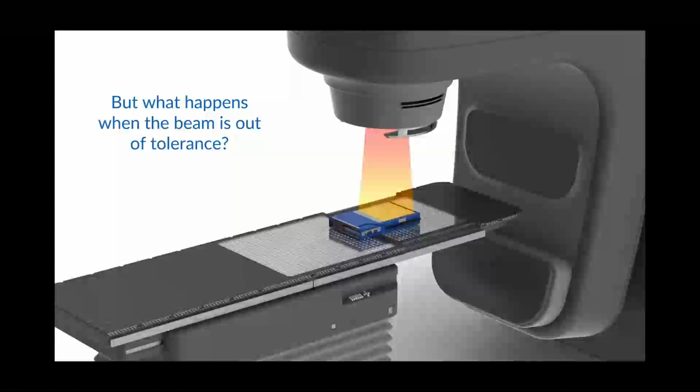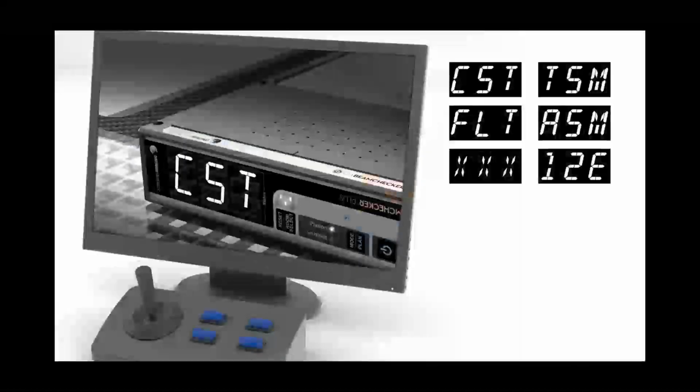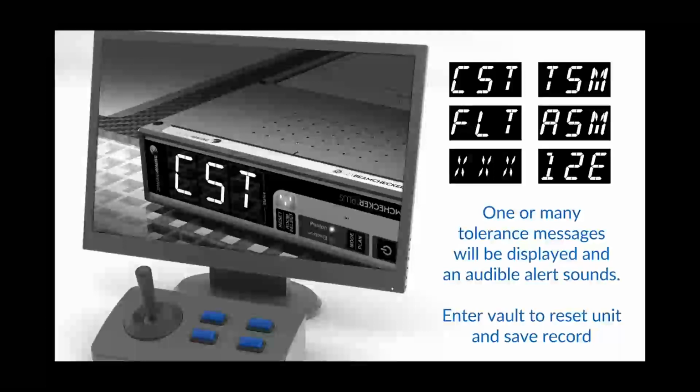You can see here just something that might be showing up incorrectly as far as the beam goes. You'll get those indicators, the various notifications: CST for constancy, TSM for transverse symmetry, flatness errors, or axial symmetry error, things like that. You'll see those on the unit itself. So if any of those messages play, you'll get an audible alert.